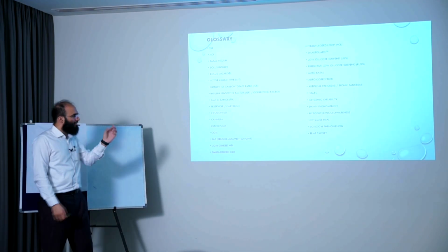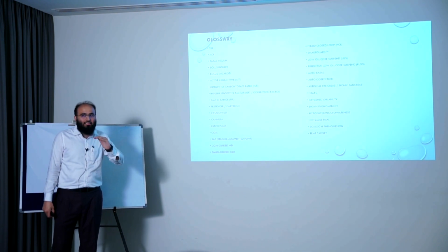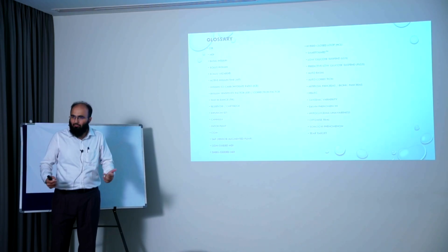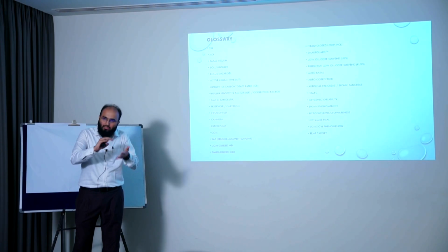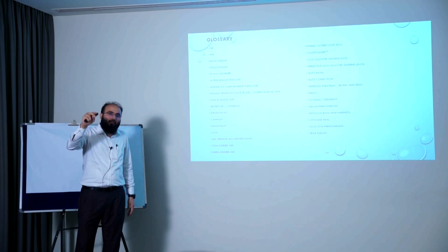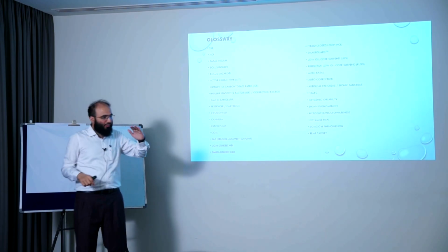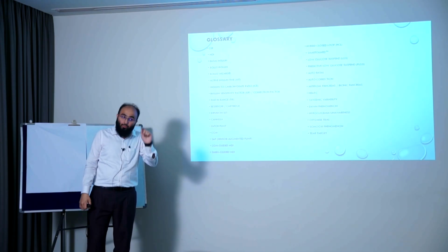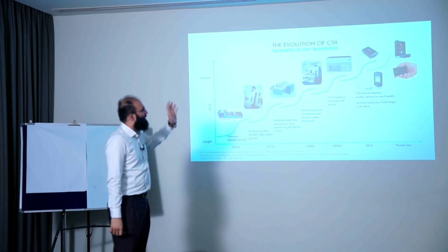And temp target is temporary target, a fancy term for temporary target, which you keep when there is a higher risk of hypoglycemia. For example, a patient on the pump, if he's going for a walk, if he's going for a swim, then he should not be getting a hypoglycemia, right? So what we do is, his usual target is 100 to 120, and in temp target, we make it 150. Another advantage of a temp target is auto correction is disabled. So if sugar is going up even beyond 150, then auto correction will not be done by the pump until you switch that off.